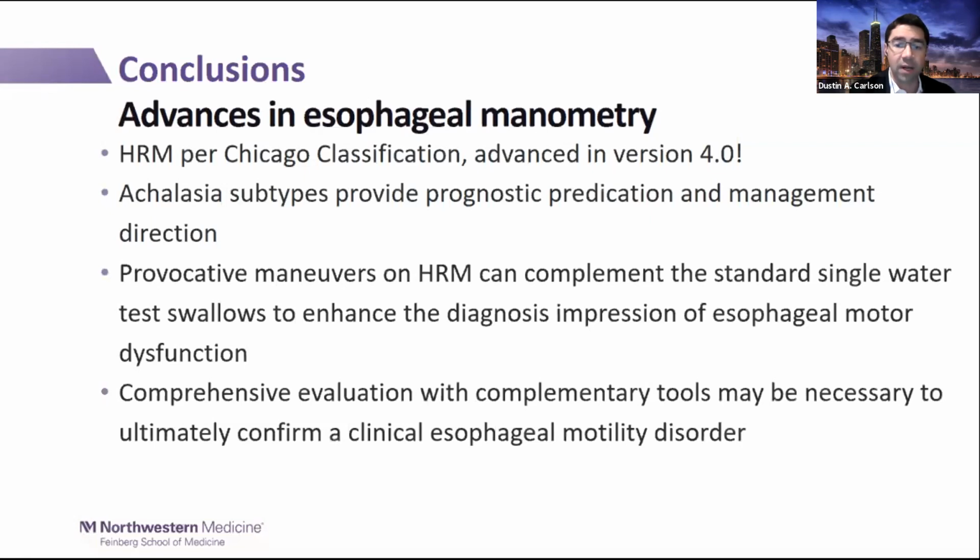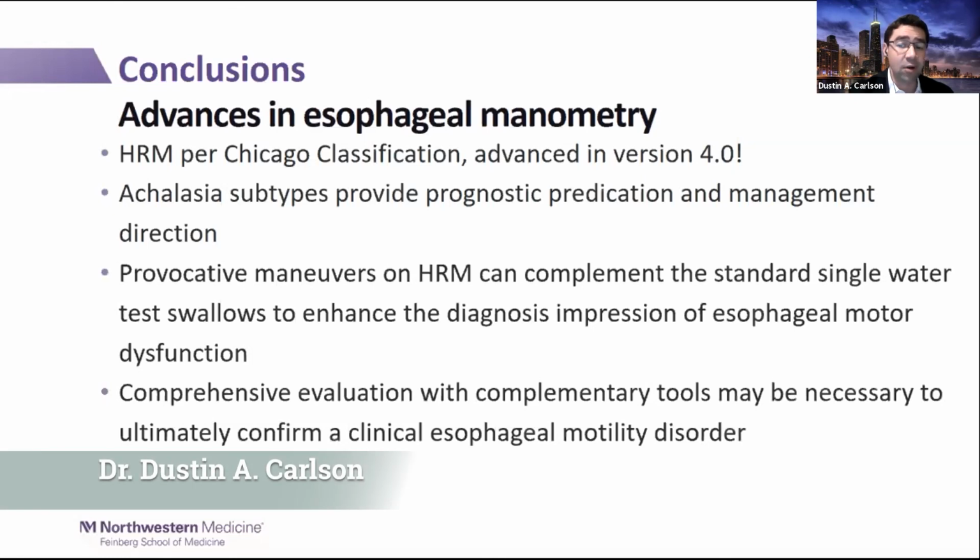However, it's also important to recognize that HRM can potentially yield inconclusive results, and in these situations, additional complementary testing with barium esophagram or FLIP may be necessary to ultimately reach a clinical diagnosis.